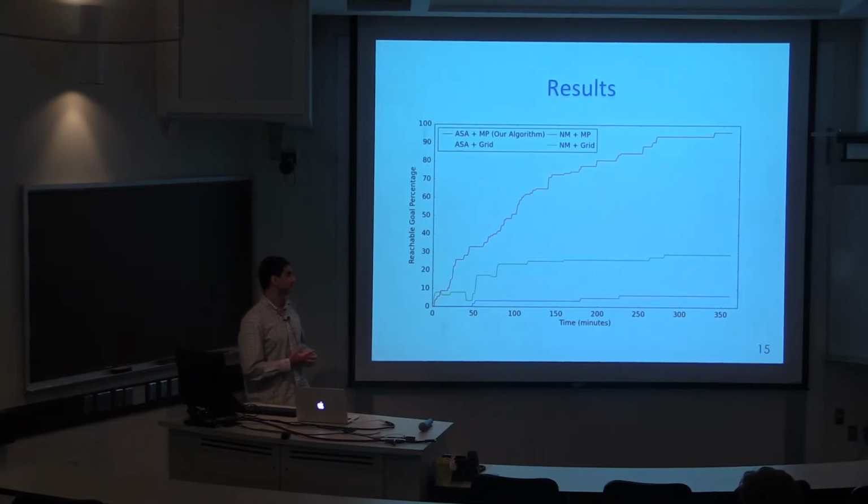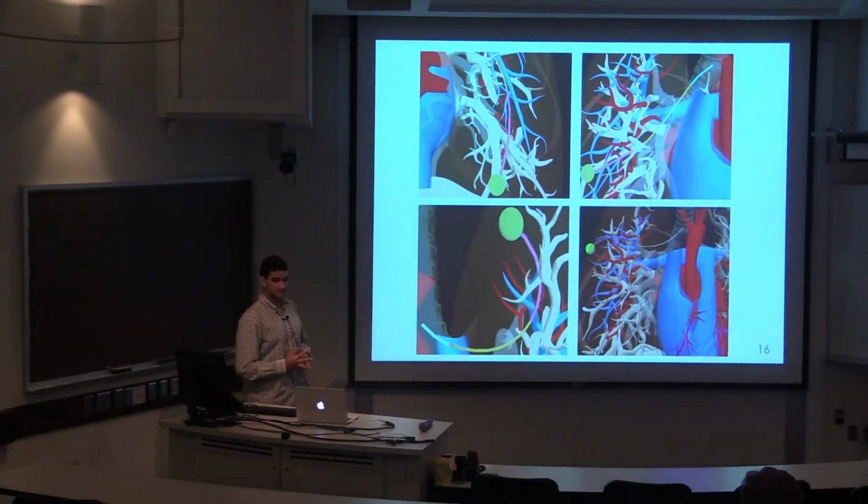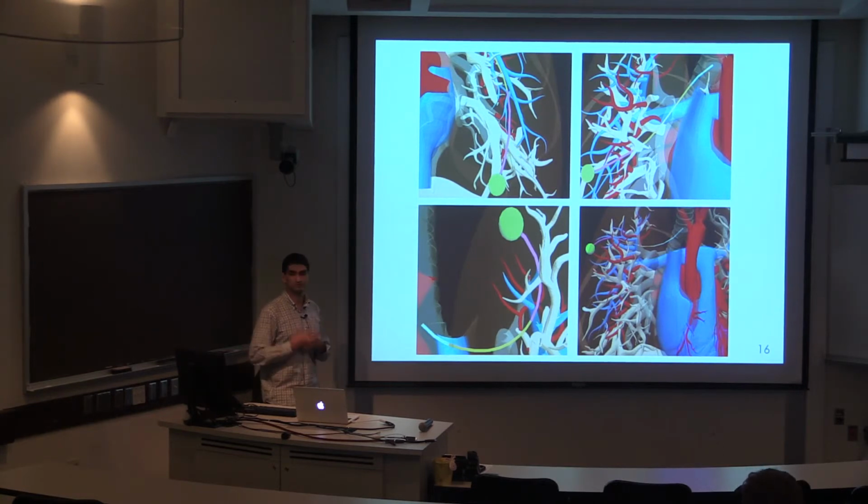So in this regard, when we were doing our work on single designs, we noticed that some designs were inherently better at reaching certain regions than others. To illustrate this property, on the left here you can see designs with high curvature and relatively small length, reaching points within the anatomy. And these regions are fundamentally distinct from the ones that a design with longer length and lower curvature can reach, which is on the right. So we conjectured that using multiple designs can result in higher percentages in reachability. If you wanted to reach the entire lung, we could use multiple designs in conjunction.